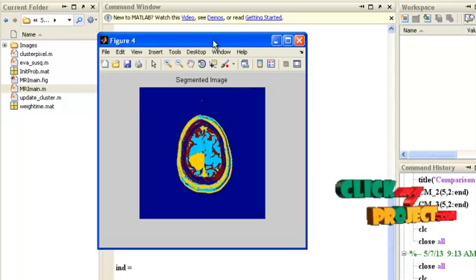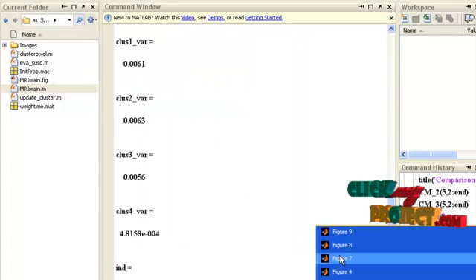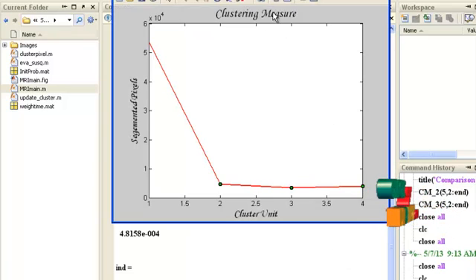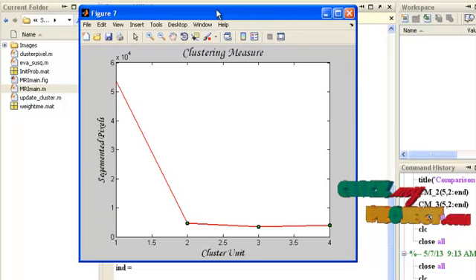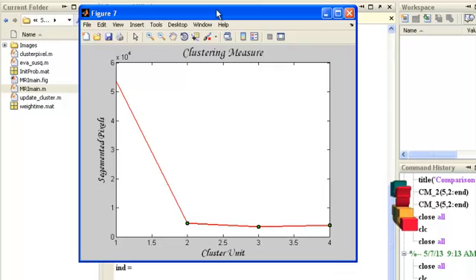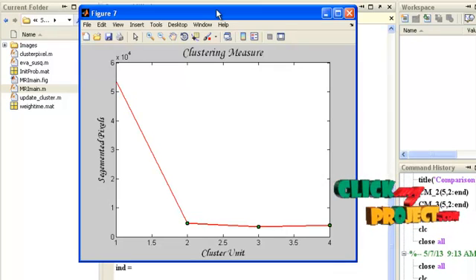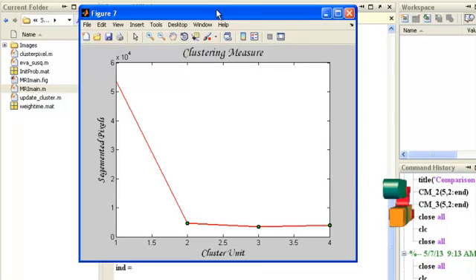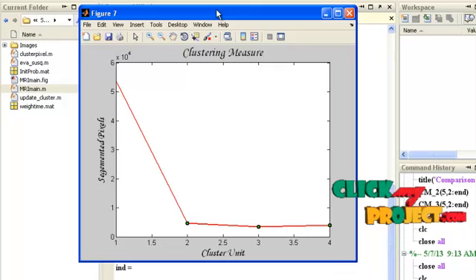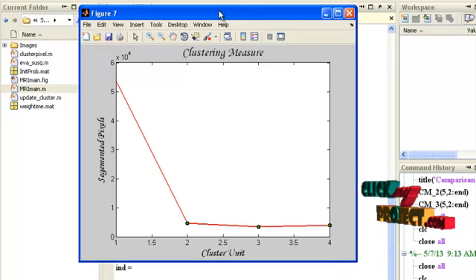The next figure window shows the segmented image in color format. This is the segmentation evaluation graph, showing the clustering measure — segmented pixels versus cluster unit, with four clusters. For each cluster, the corresponding number of pixels enclosed in that cluster is computed and displayed in this graph.